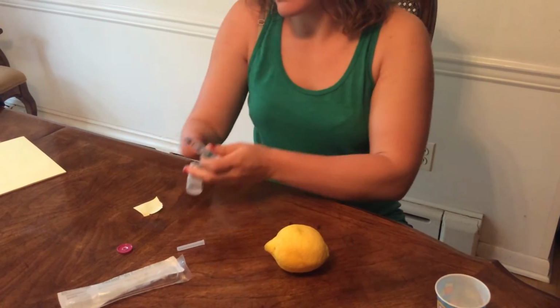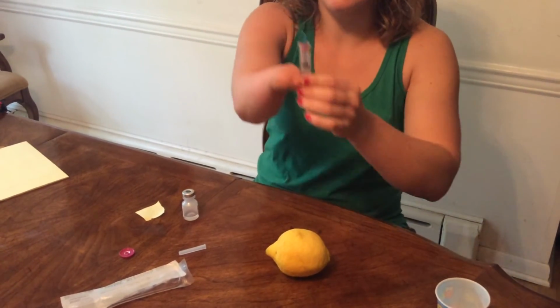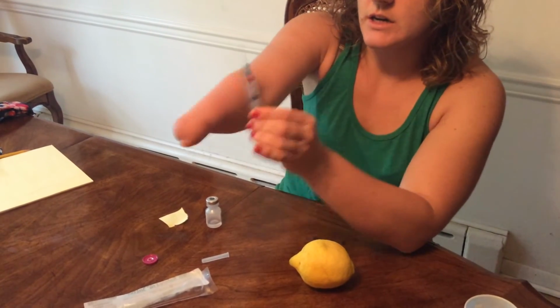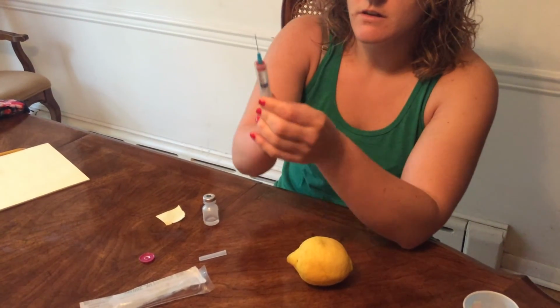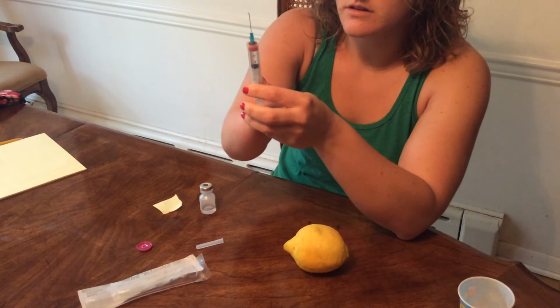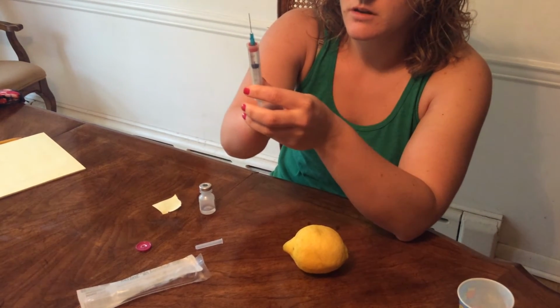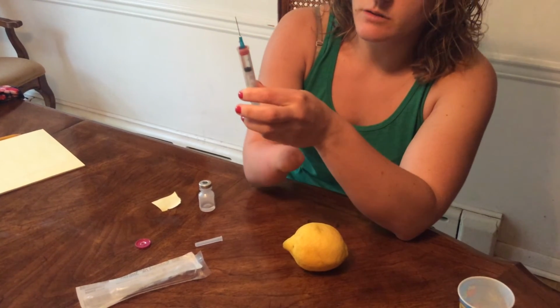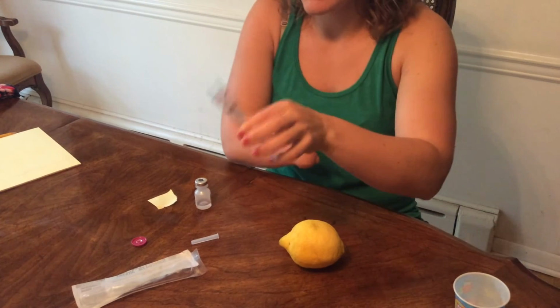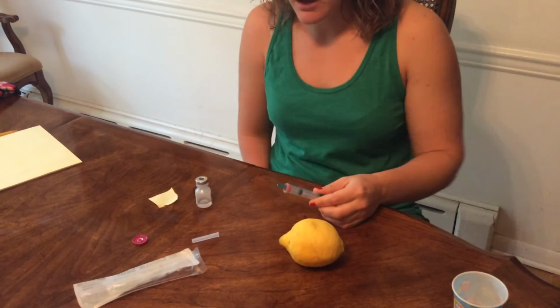Okay. The next thing you're going to do is get the bubbles out. So there's some air in the top, there's some bubbles down here. You're going to knock it, get the bubbles out, and get it to the top so that the top of the black is at the 1. Okay? So it's just at the 1 now. Shake your extra liquid out, whatever.